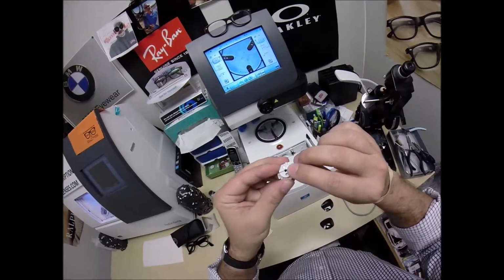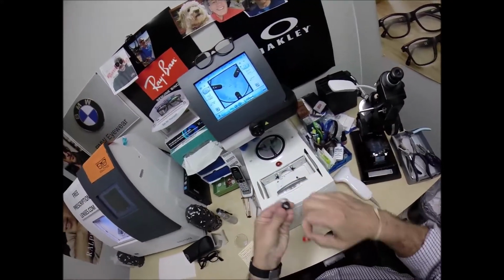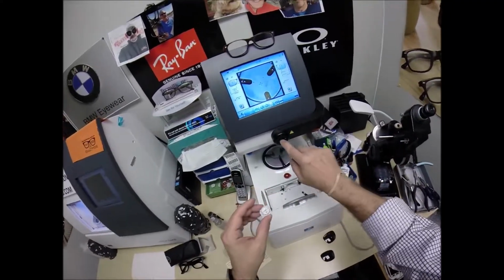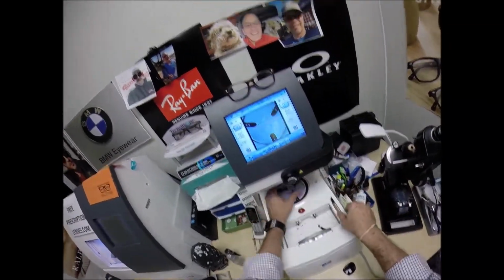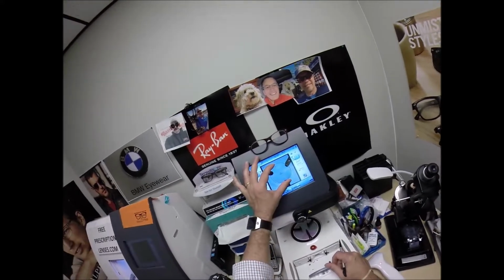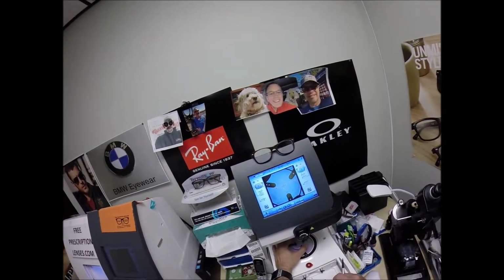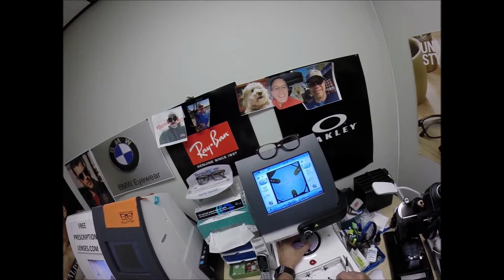Now on the back is a silver button that is a magnet. It's going to do its job twice. The first time is I'm going to pull the paper away to make the black side sticky. I'm going to line up the magnet with another magnet there in the arm so it stays there. And the reason why I put those 3 dots on there, it tells me that it's oriented in there just perfectly. So we're going to get everything lined up exactly the way it should be.